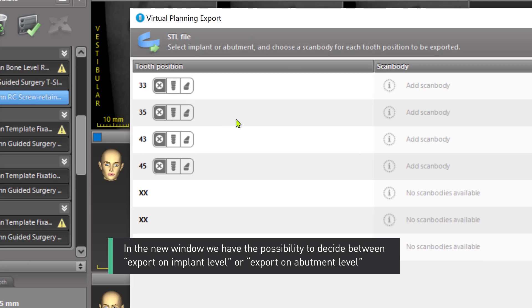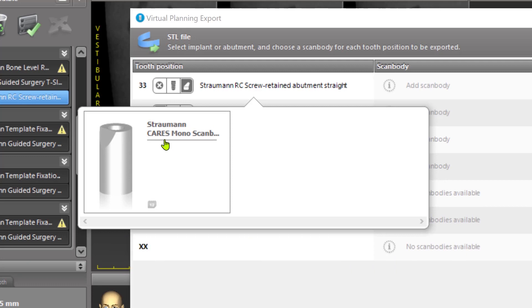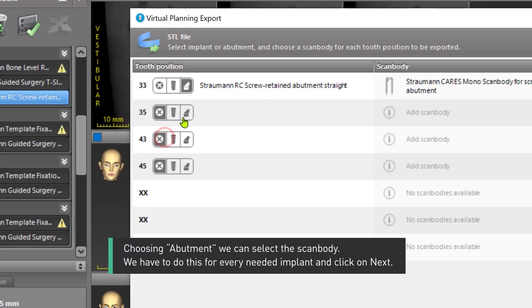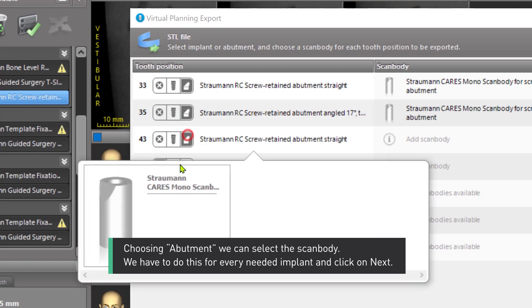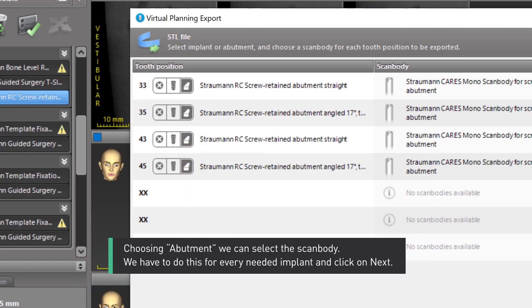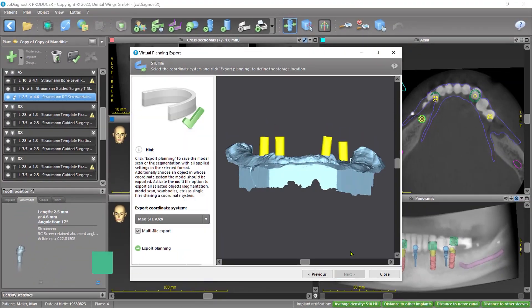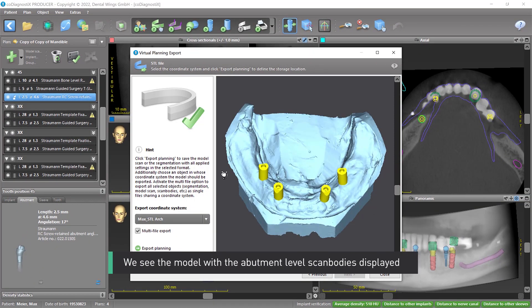In the new window, we have the possibility to decide between Export on implant level or Export on abutment level. Choosing Abutment, we can select the scan body. We have to do this for every needed implant and click Next. We then see the model with the abutment-level scan bodies displayed.